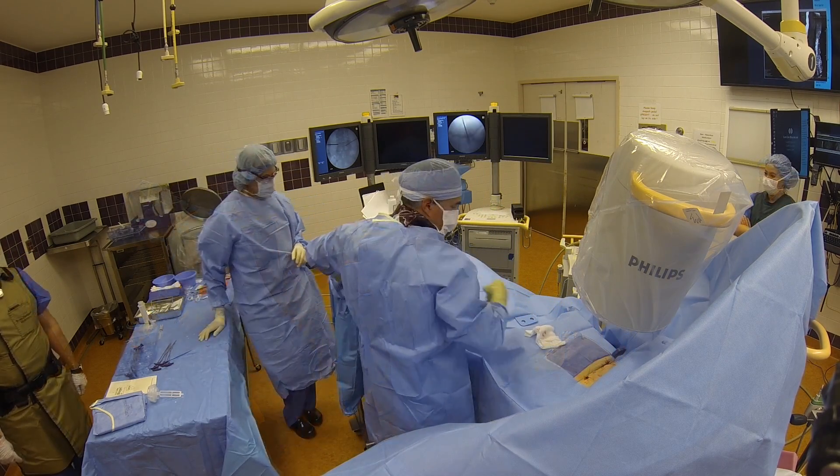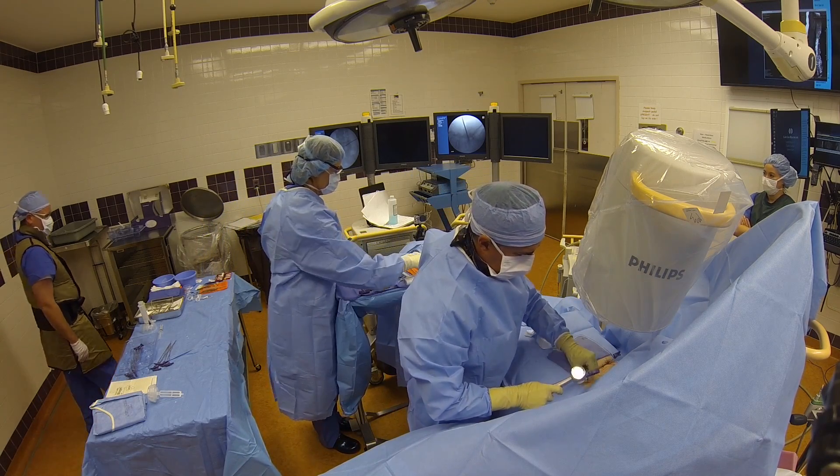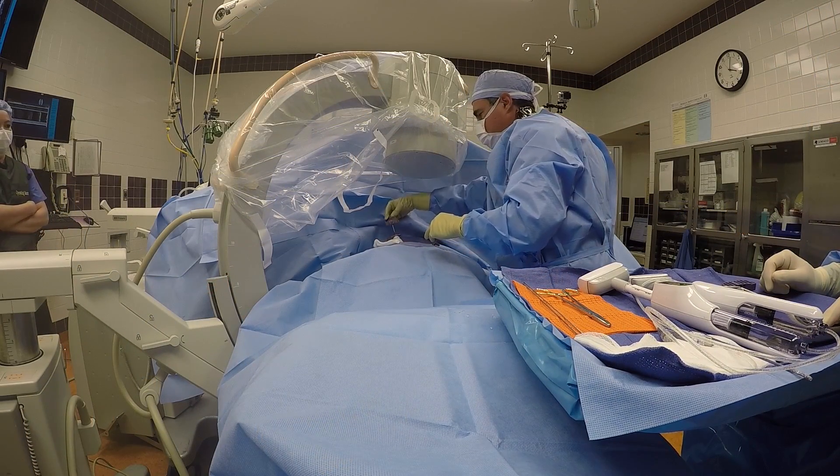After making small stab incisions, I place a needle into the bone. I then place a guide wire through the needle, a little deeper into the bone. I then remove the needle, leaving the guide wire in place.